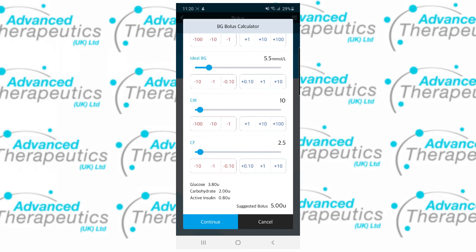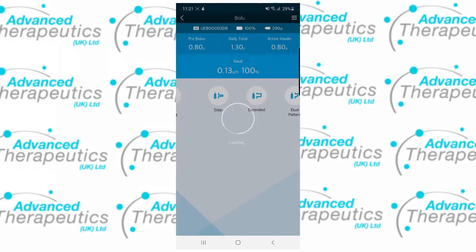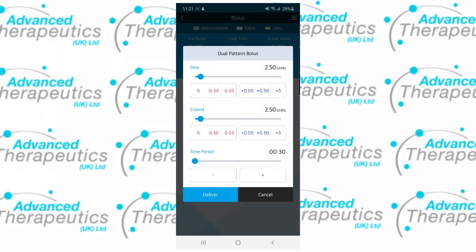Down at the bottom of the page you'll see a split of the dose as well as the suggestion given. Tap continue to move forward and choose how you'd like to deliver that bolus. With the dual pattern bolus you can decide how much is given instantly and how much is given as an extended, again setting the time period to your liking, all the way up to 8 hours.